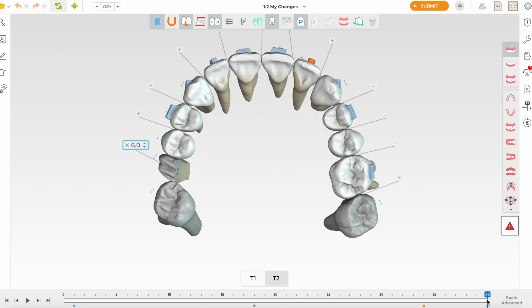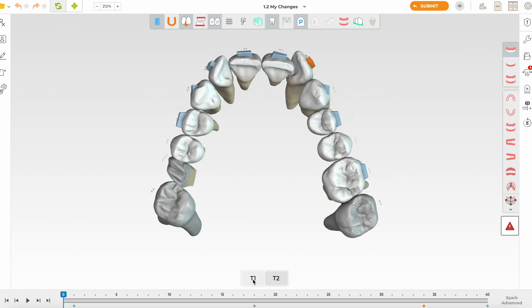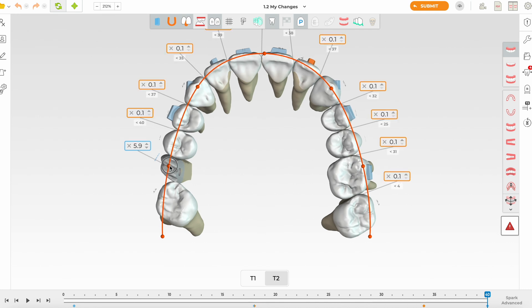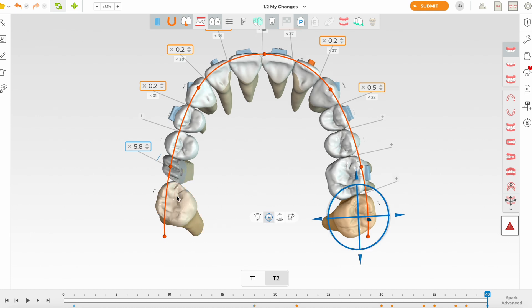Looking at the transverse at T1 and T2, I think the expansion is quite advanced — this is a lot for an adult in their late 20s or 30s. Expanding the upper first molar so much but not the second molar will create an asymmetric arch. We're going to make certain teeth unmovable and reduce the expansion, removing more from the posterior region.